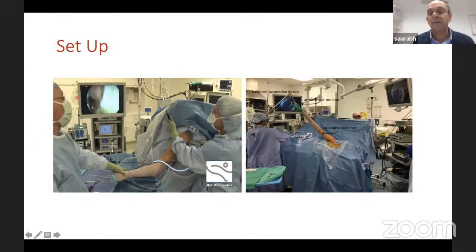Now, if you come to the lateral position, the advantage is there's hardly any problem with cerebrovascular events because the patient is supine. But the disadvantage is we're not that familiar, and because we give traction, there can be traction neuropraxia. Anterior portals can be difficult. If you need to convert to an open procedure, it can be difficult. But again, the advantage is almost no cerebrovascular events. And the other advantage is because you're giving traction, the joint opens up, both your glenohumeral joint and your subacromial space. So both have their pluses and minuses. Based on your training and your practice, you can pick either. There's no right or wrong in terms of patient positioning.